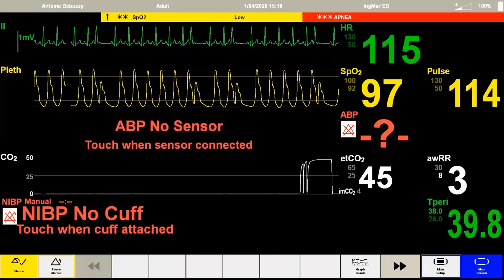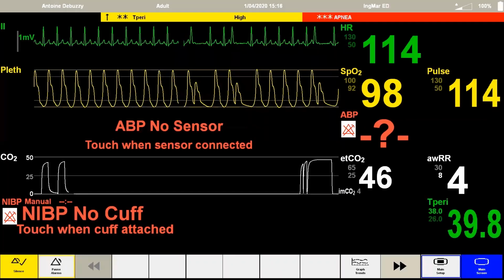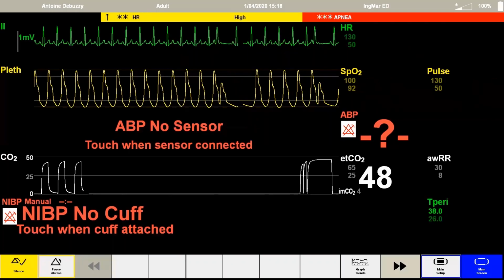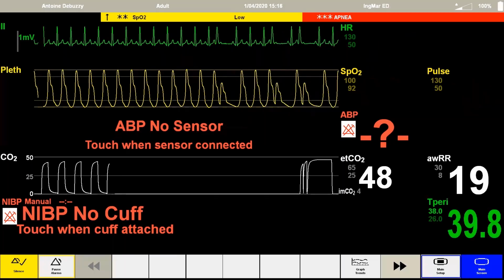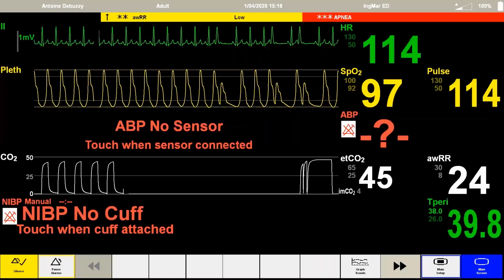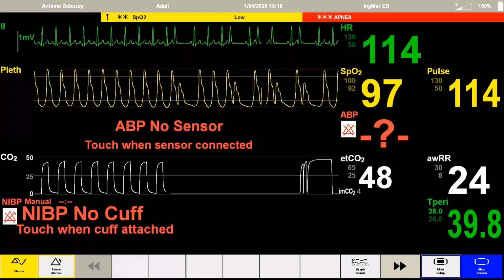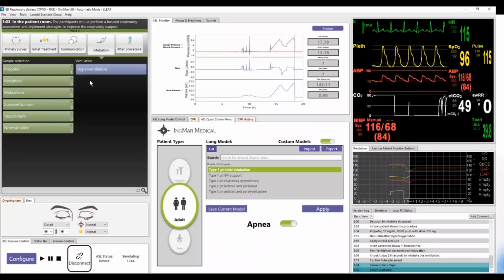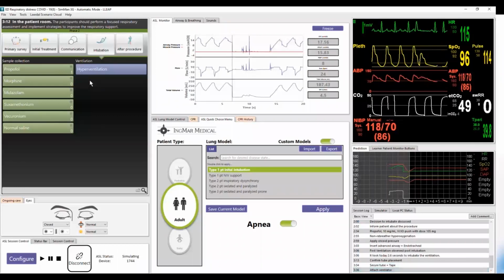It's worth noting on the patient monitor, when you actually see the end tidal CO2, that is a combination on the patient monitor between that by the ventilator and spontaneous breathing. So you can see now after we've intubated, that airway respiratory rate is being sensed and increases over time. On the instructor PC, when we see that in the instructor room, you'll notice it always says 0 if they're ventilated breaths. And that's because on the instructor PC, it only shows the respiratory rate of spontaneous breathing.